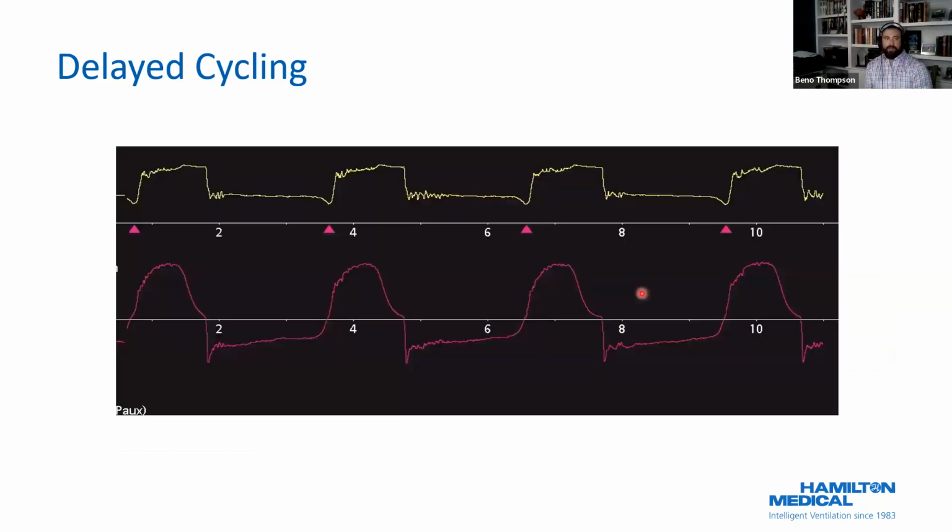Most of the waveforms that you're going to see, and I'll show you that in a little bit, but we're going to blow this up, right? So how do you figure out how much I time your patient needs? You draw a line over the inspiratory curve where they're actually making effort, and then you draw a line over the plateau, and where they intersect is where you should be cutting off your inspiration, or cycling into exhalation.